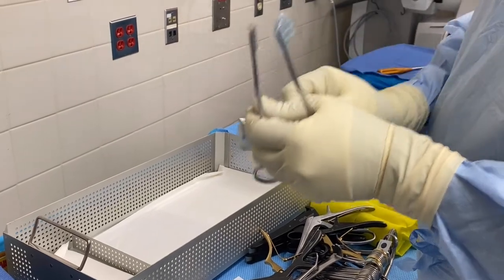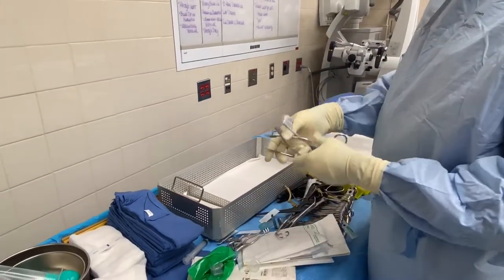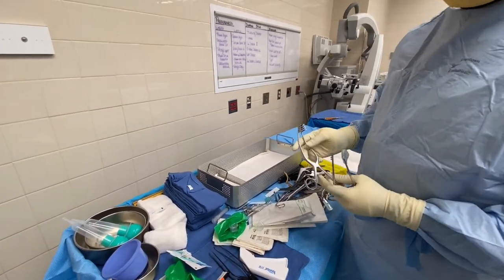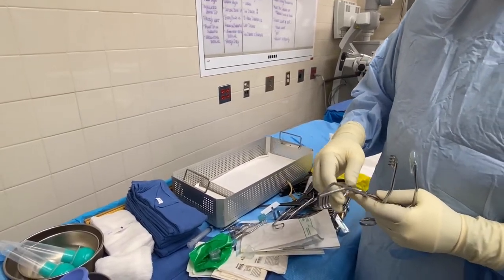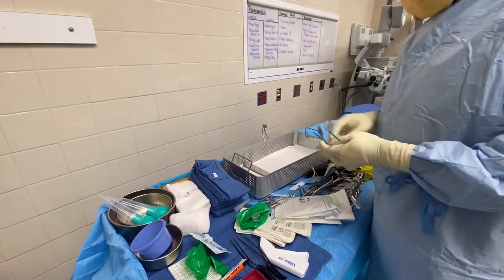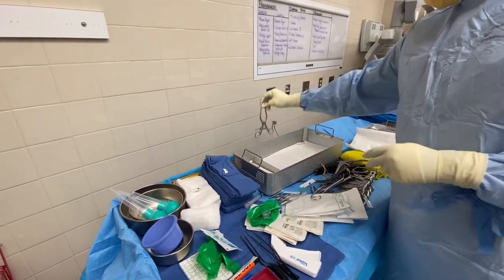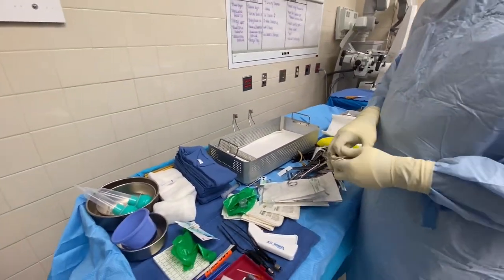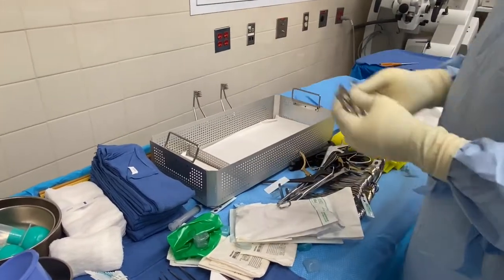You're always going to have cerebellar retractors. Most likely we're not going to need them because we're not going to go deep inside the brain — we're just going to leave them there just in case. We have cerebellar retractors and small weedies. I'm going to put one on the mayo stand next to your Kerrison.